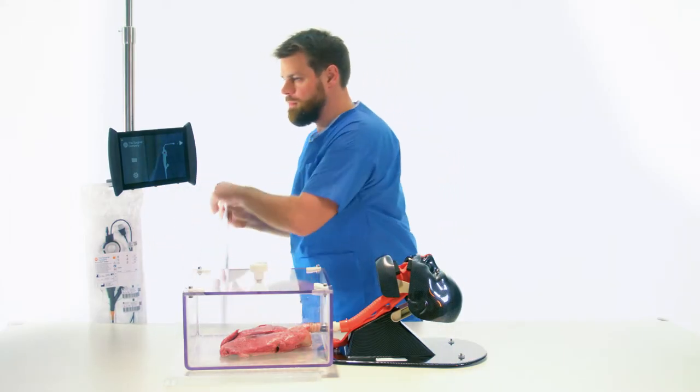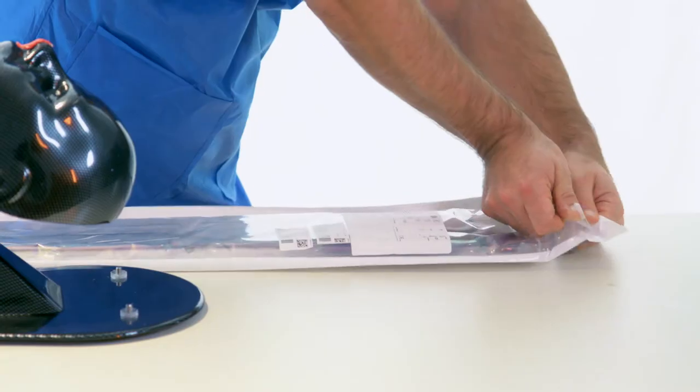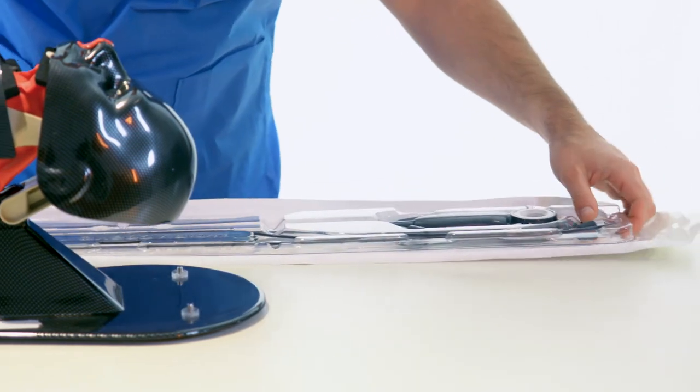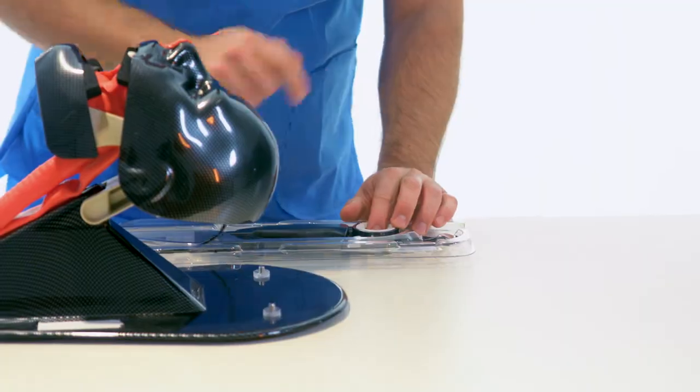For this procedure, a BroncoFlex Agile is used for compatibility with endotracheal tube sizes of 5 mm and larger. There are no protective covers or accessories that need to be removed.